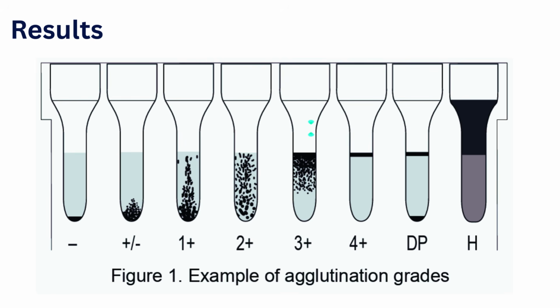So this one is easier. See, this is hemolysis, and this one is the blood, the black parts. If you can observe hemolysis happening here but not in the gel, that's hemolysis. And then this one, upper part, and at the bottom, unagglutinated cells, there's a double population or a mixed field reaction. But I prefer that you answer me with a mixed field reaction rather than using the phrase double population, okay? And then we have this one, 4 plus, down to 3 plus, 2 plus, 1 plus, then plus minus, and then you have your negative.